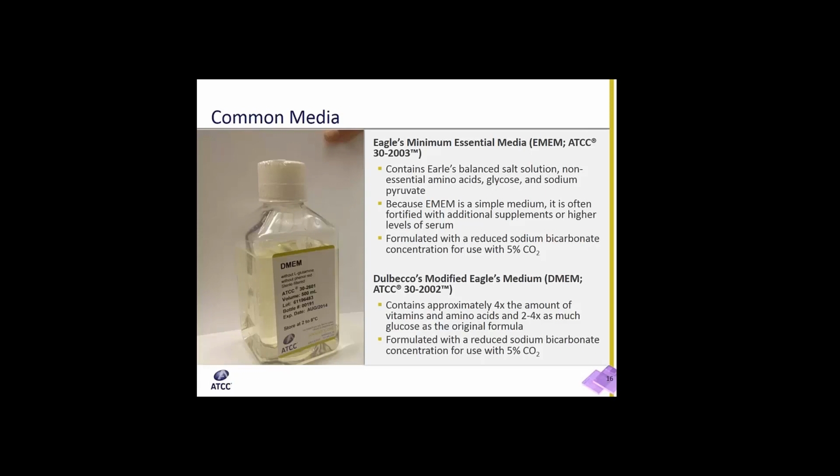Also pay attention to whether the media contains HEPES buffer. Oftentimes, HEPES as well as other organic buffers can be used with many cell lines to effectively buffer the pH of the medium. In fact, some of these compounds that are used in the buffers can be toxic. We have seen that HEPES has been shown to greatly increase the sensitivity of media to phototoxic effects induced by exposure to fluorescent light.